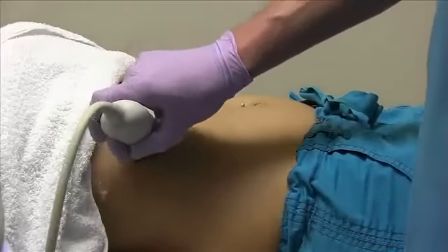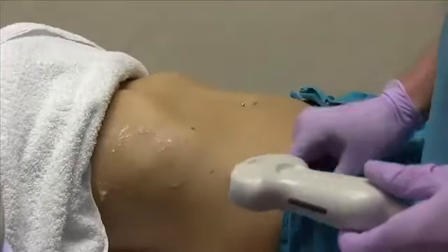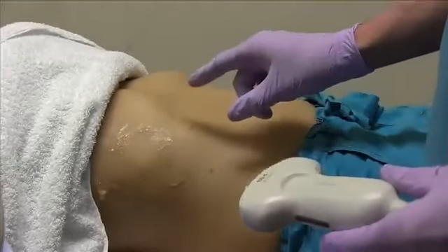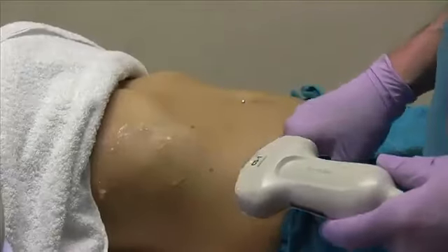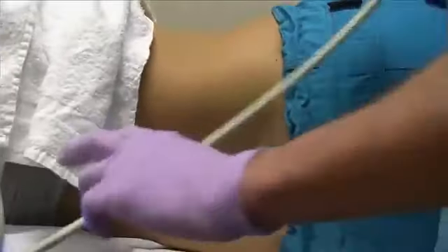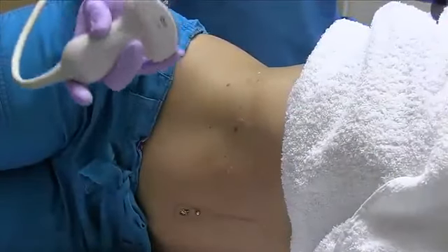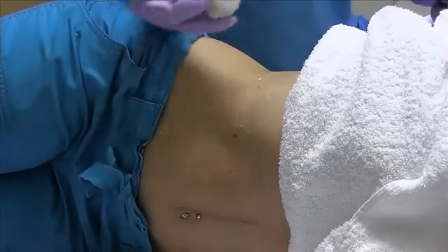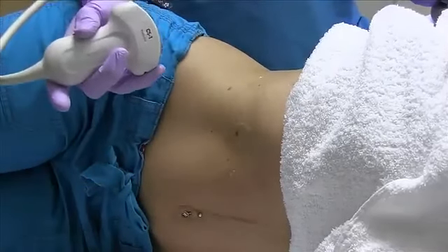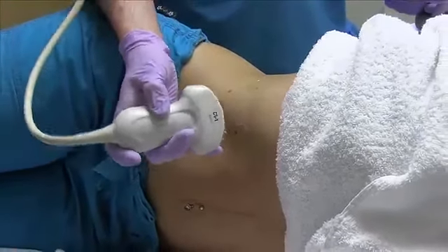For the gallbladder, we also get decubitus pictures just to make sure there are no stones trapped in the fundus or the neck of the gallbladder. So for that, I'm going to have you turn onto your left side away from us. For this, the gallbladder usually moves a little bit forward. After you get your supine pictures of the gallbladder, you want to decubitus the patient just to make sure there are no stones stuck in the neck of the gallbladder.